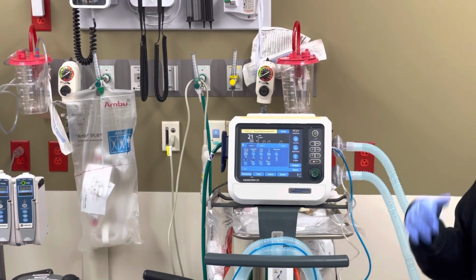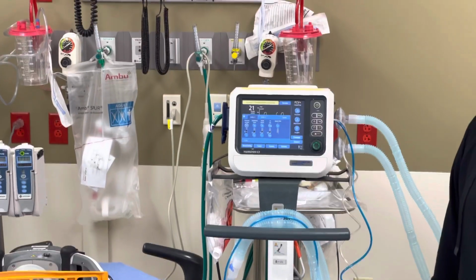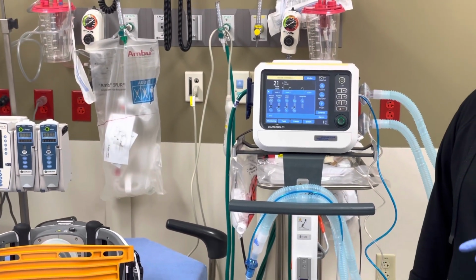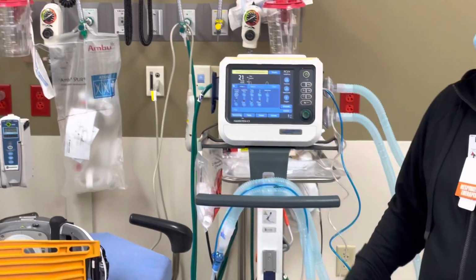I think mainly our issue is that they're intubated and sedated. We can get them on the vent, but once we get everything settled, it's alarm, alarm, alarm, alarm. So I should always check my alarms first and make sure an x-ray happens.